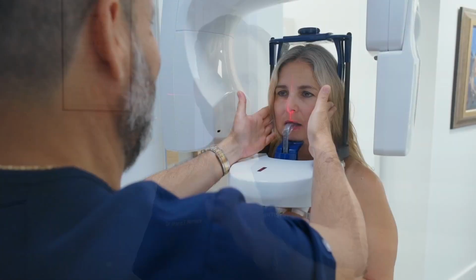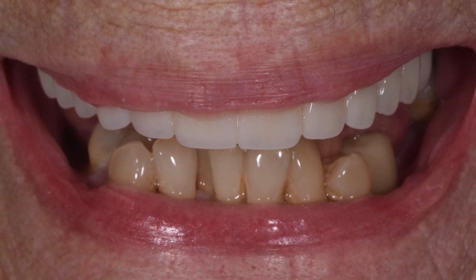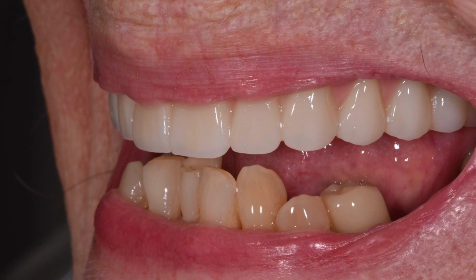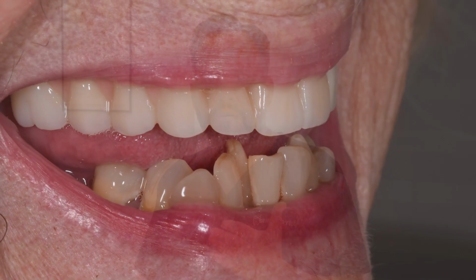I want to register that through a photo, so that when I'm planning my cases with the CBCT and all the other tools that I need, I'm sure that I have this static image of the patient's mouth, so that I can remind myself what this site is going to look like, and imagine and plan in my head how I am going to go about executing this surgical procedure. So clinical photos, extremely, extremely important.